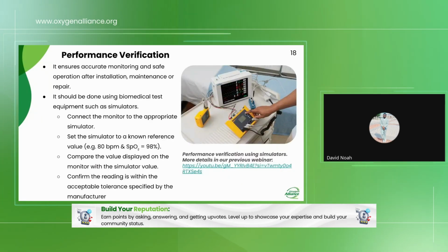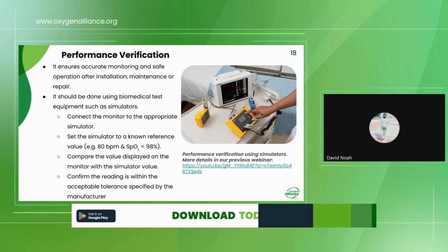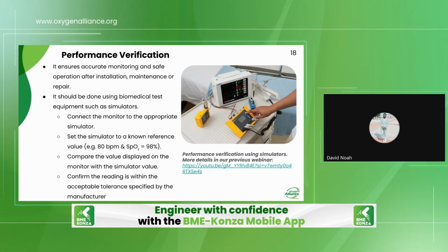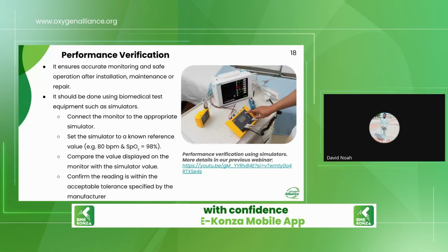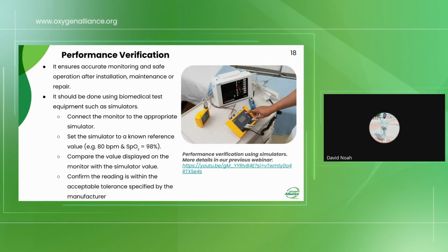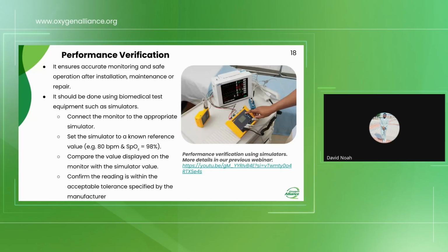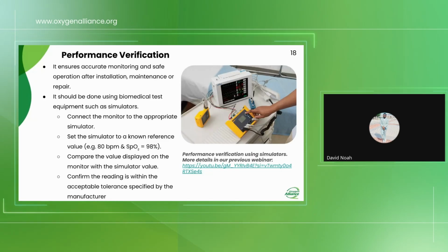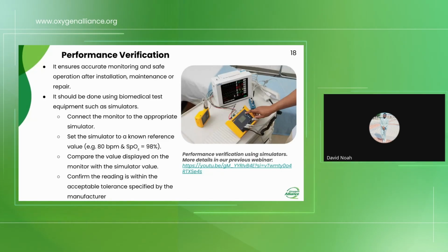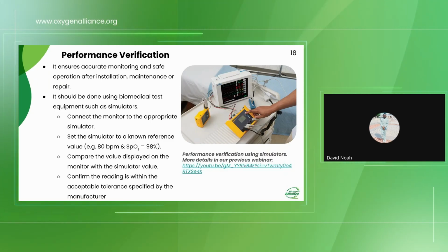Another important aspect of planned preventive maintenance is the performance verification. Basically, in this case, you are trying to ensure that the modules are providing accurate readings on the patient monitor. So it ensures accurate monitoring and safe operation after installation, maintenance, and sometimes repair.